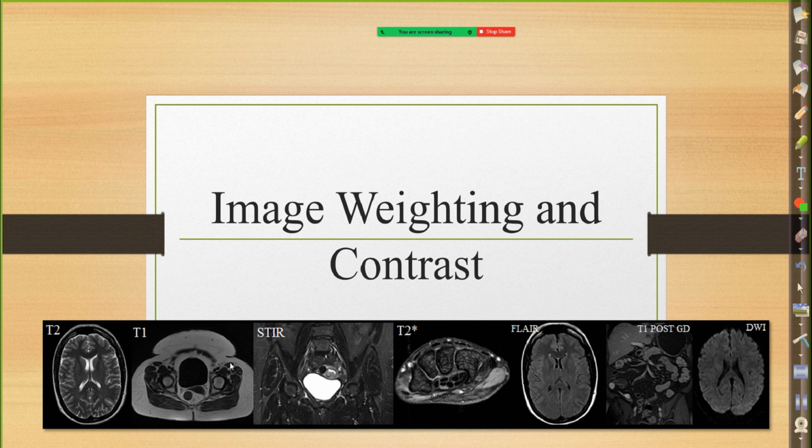So it's like the radiologist goes through each sequence and goes, okay, I see something on the FLAIR, and then I compare it to the diffusion. Okay, that makes it definitive now, it's an acute stroke. So you're getting all this information. It's kind of like solving a crime with all these different clues, with all these different types of image weighting images that you get in MRI. So if you ever had any question why they're getting multiple acquisitions of an axial, this is the reason why. We don't just get one axial, one coronal, one sagittal, and call it a day.